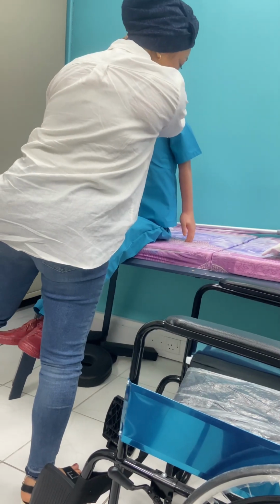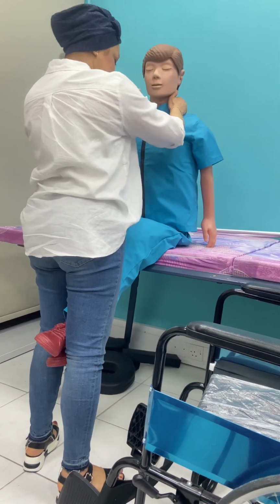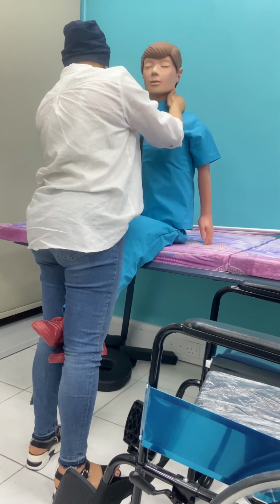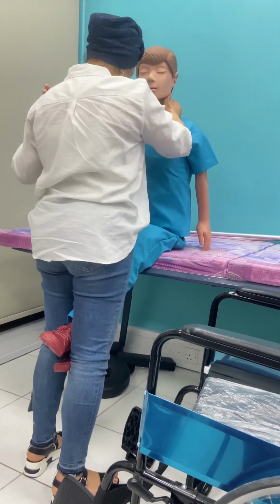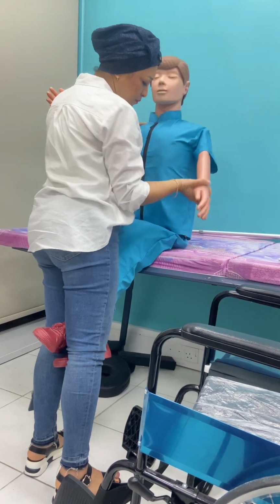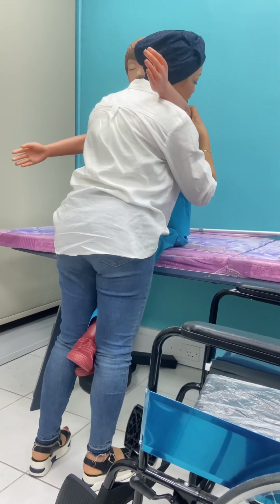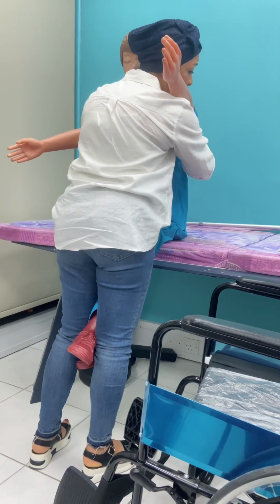Second very important thing is to make sure that his legs are between my legs. And this is for his safety so that he doesn't move, he doesn't fall down. And I ask him, so now please, I need you to put your arms above my shoulders. You should be more flexible. Actually, this is very difficult. I pass my arms around the patient.